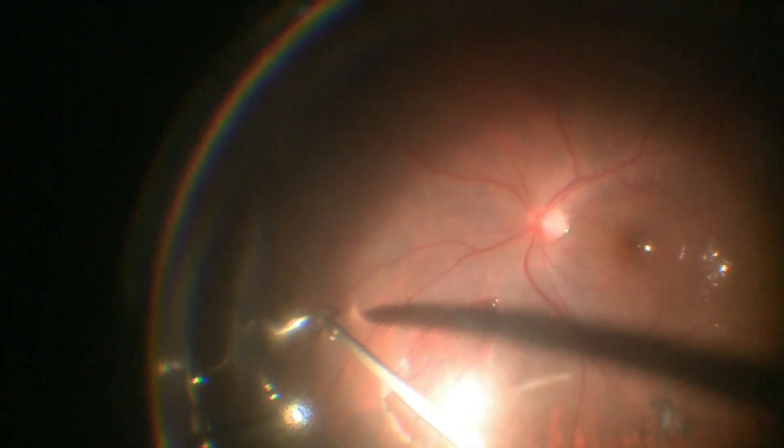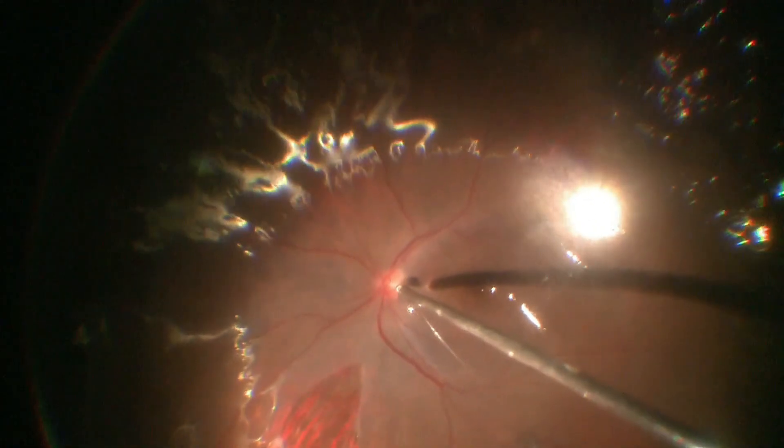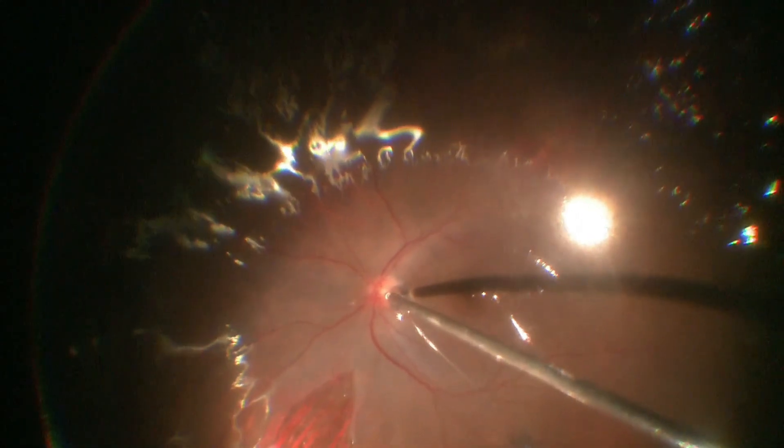From the retinal break, SRF was drained out. PFCL aspiration was carried out at the posterior pole. Endo laser was performed around the retinectomy.